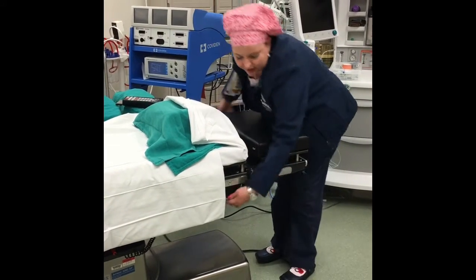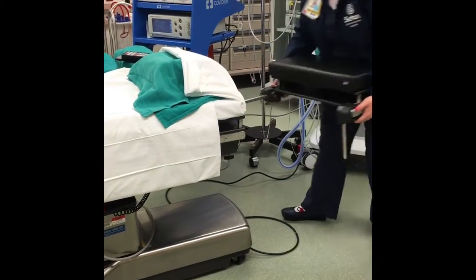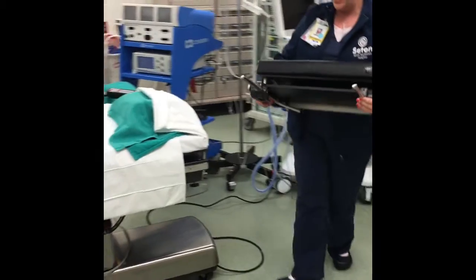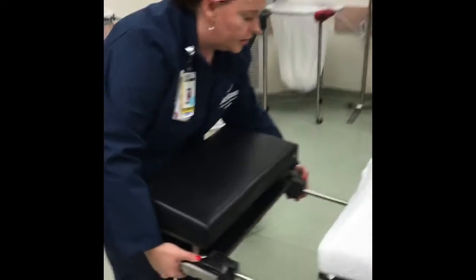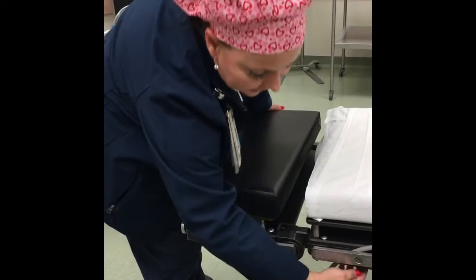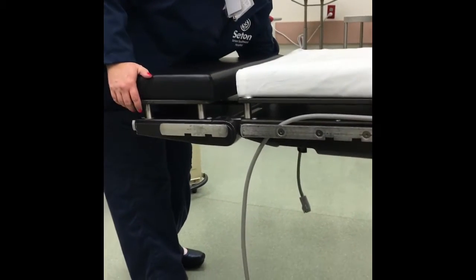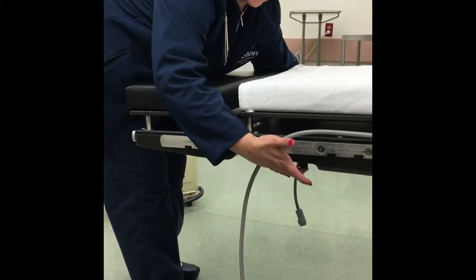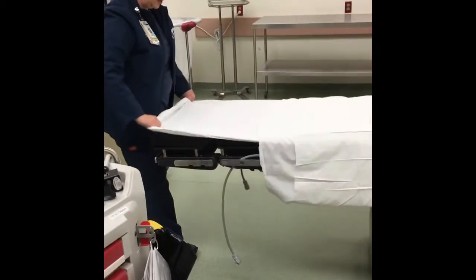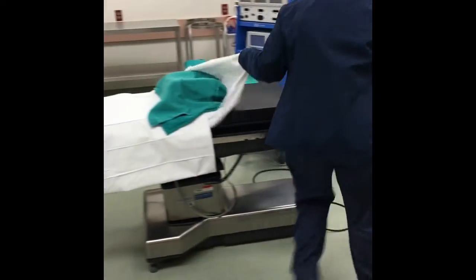And there's just some little clamps down here on the bottom that you unscrew until it's loose. And you take this whole section out, and then you put it at the foot of the bed. And there's a little notches that it fits into. And again, you have a little screw down here to tighten it, and one on each side. So it's right here. Okay, and then you just pull down your sheet to make it fit, to get your bed nice and back in order.